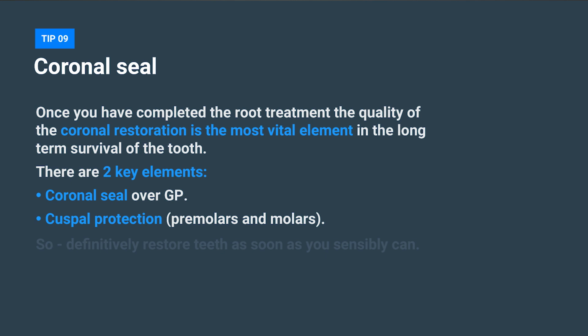The other thing to bear in mind is the timing of that restoration. Ideally, we want to restore those teeth as soon as we sensibly can. These days, with single visit endo and the ability to use something like CEREC for a single visit crown, we can do it all in one visit.